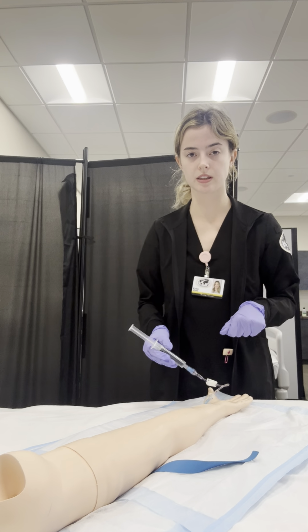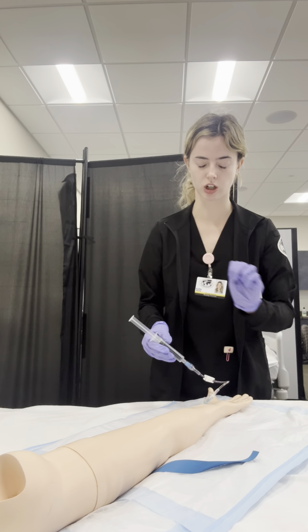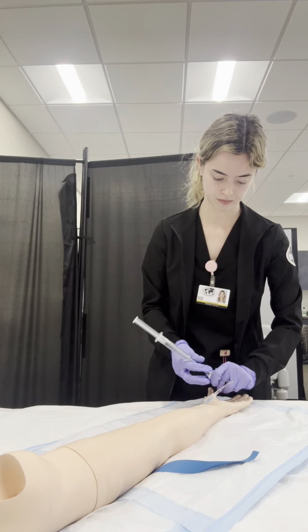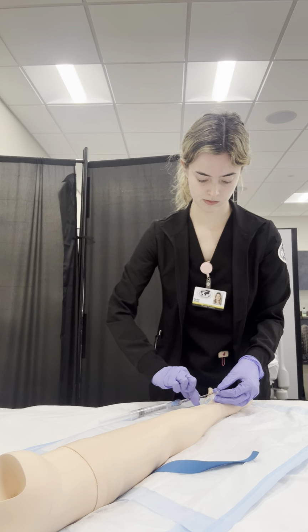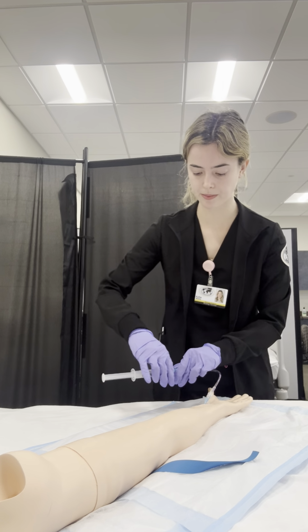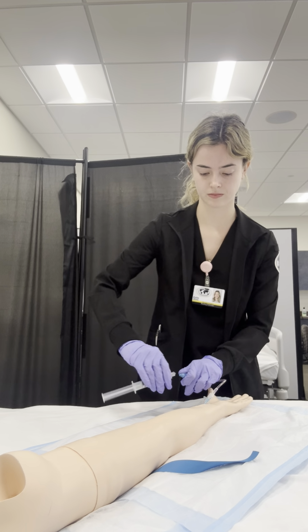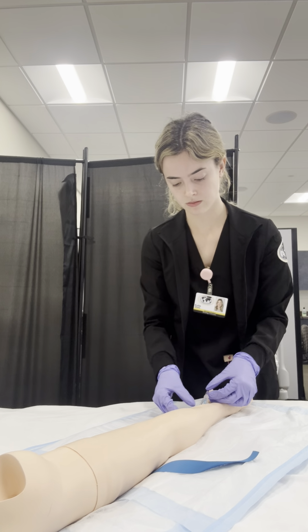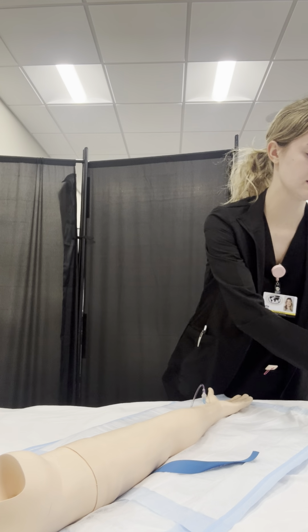I'm looking for any swelling at the insertion site. There's no swelling. Insertion site looks good. So now that I have flushed all 10 milliliters, I'm going to apply my clamp. Okay, so the line is clamped, and I'm going to remove the saline. Okay, my insertion site still looks good, so now I'm going to apply dressing.